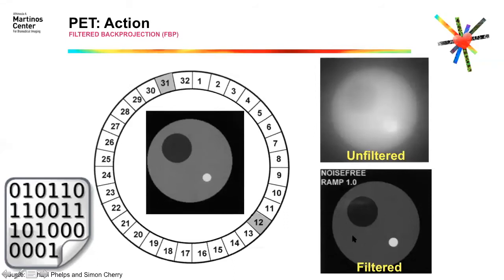Because we know that from all those lines of response, those areas that are very uniform in intensity are very likely not going to be contributing to the image. It's only areas where there are changes in the image, high frequency changes, that will be contributing. And that's basically what is creating this image very similar to what in reality is inside the scanner. And this is called the filtered back projection.